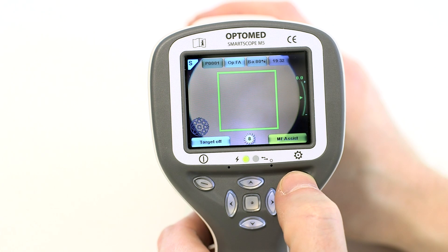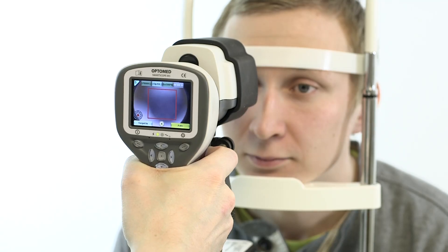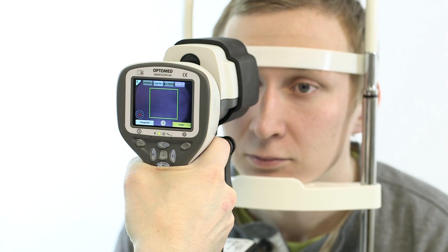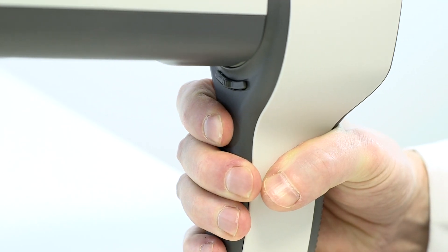This is the easiest usage mode for inexperienced users and is also highly recommended for non-cooperative patients. Auto mode works in the same manner as any other digital camera. When auto mode is selected, the camera will start focusing immediately as the shutter button is pressed to the first position. To capture the image, press the shutter button to the second position.